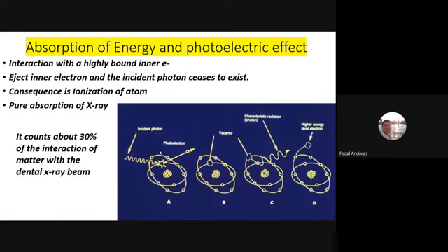This counts for about 30% of the interaction of matter with the dental X-ray beam. With the dental X-ray, the first one, penetration, was about 9%. The absorption of energy, the photoelectric effect, was about 30%. Okay?